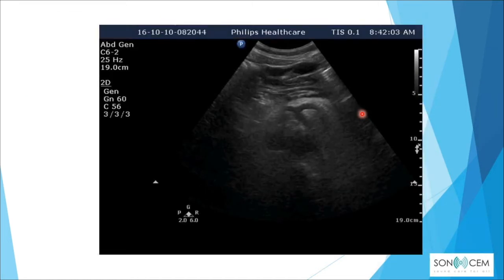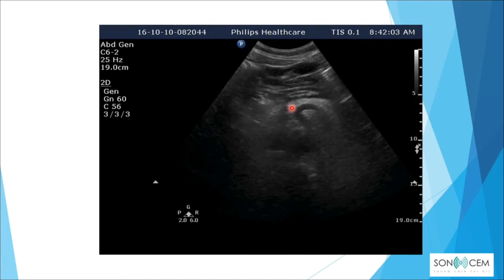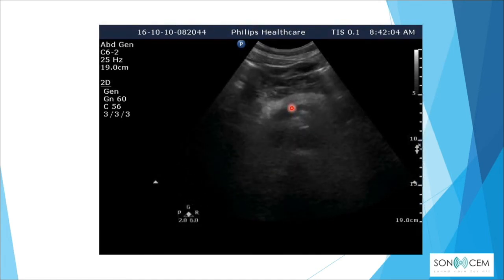Once the image is acquired, we move the probe accordingly to obtain the celiac trunk and its branches.